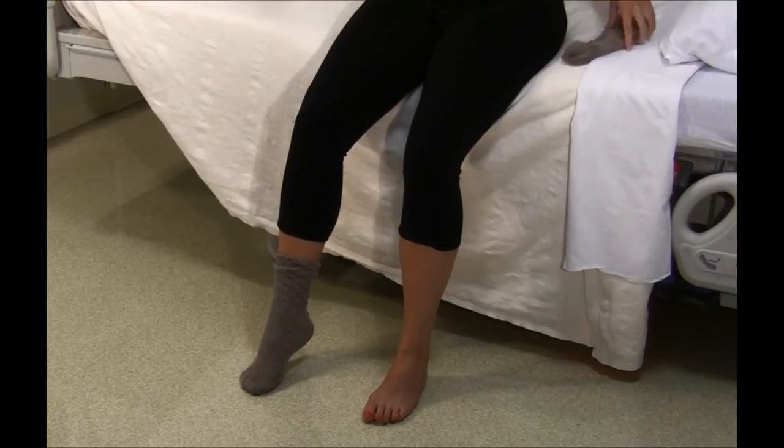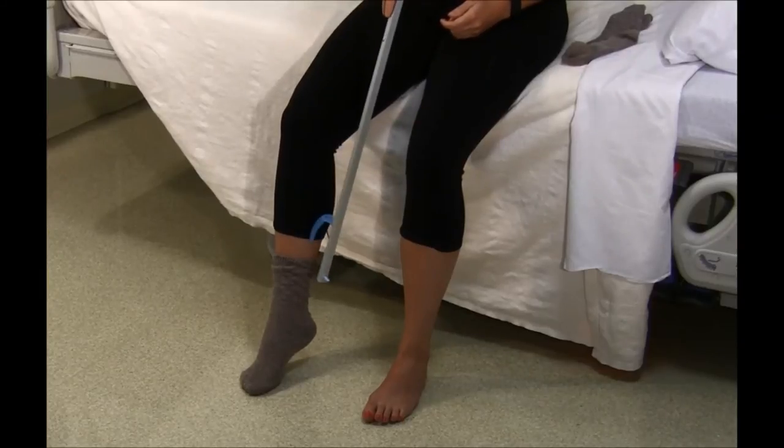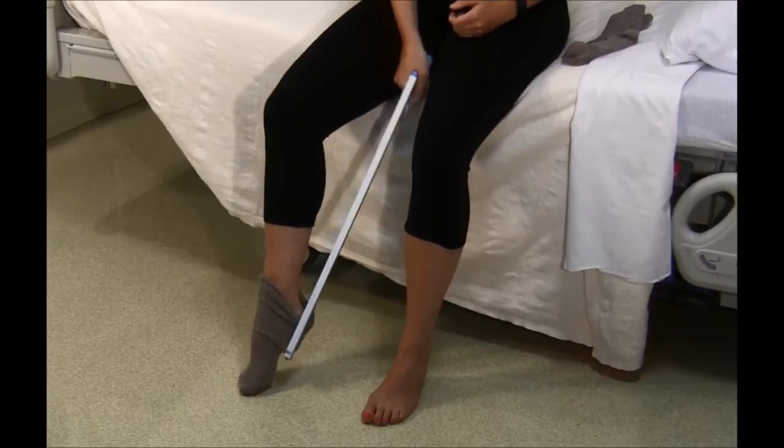If you use the movable arm, place it at the top inside of your sock and push it over your heel. Do not push it all the way off. Pinch the front of your sock and pull it off.